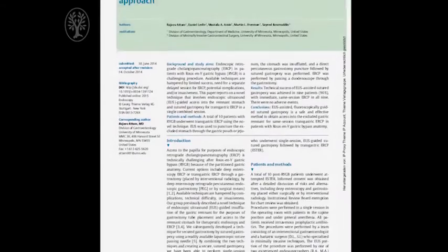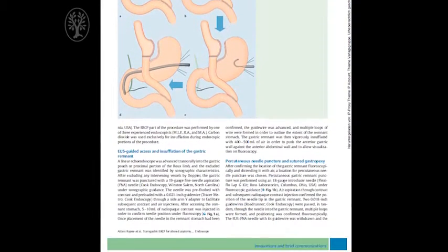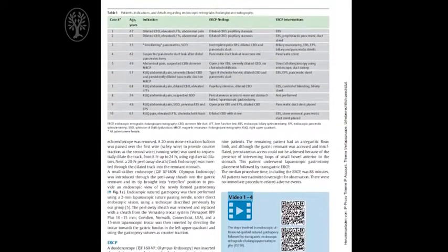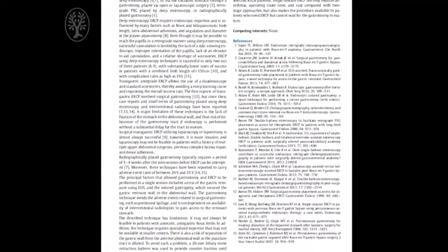With increasing prevalence of obesity, weight loss surgeries are being performed in large numbers, with Roux-en-Y gastric bypass being the most popular option. Patients who undergo weight loss surgery such as Roux-en-Y gastric bypass are at a higher risk of biliary disease. Access to the papilla for purposes of ERCP is technically challenging in patients with Roux-en-Y gastric bypass anatomy due to the partitioned stomach.